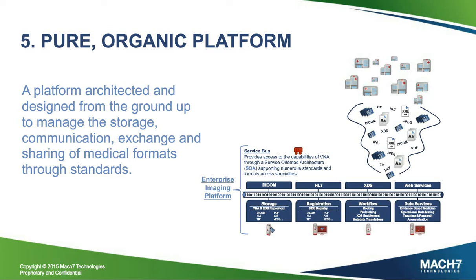I think both as David, you and Boris highlighted, there's some similarities there around having that pure platform to really enable flexibility with your viewers, whether it be the Tomo viewers needing the images back in their native formats, or ECG strips needing to come back in their native formats. I think that's important. Also helping out with those future switching costs, if your data is pure and native, then it's going to really simplify that and lower some costs.